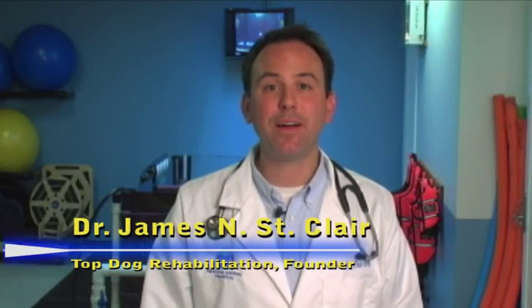My name is Dr. James St. Clair and I'm the founder of Top Dog Rehabilitation, and I'm incredibly excited you selected the Walking Wheels cart. This cart is very adjustable, it is incredibly stylish, and it transports amazingly. In addition to that, it's very easy to use and it works really, really well.